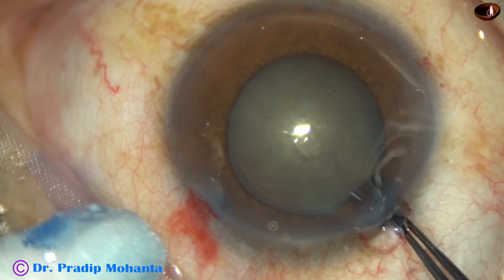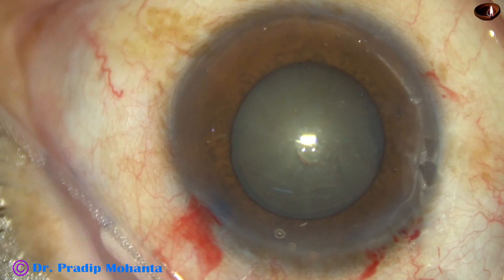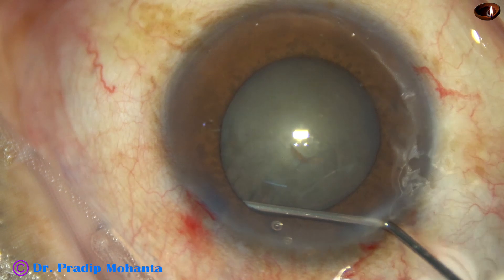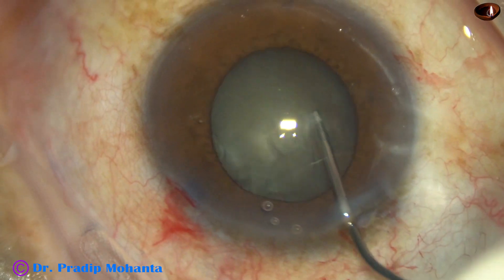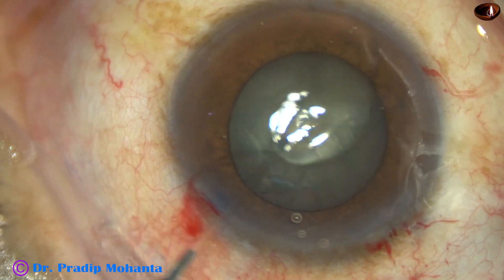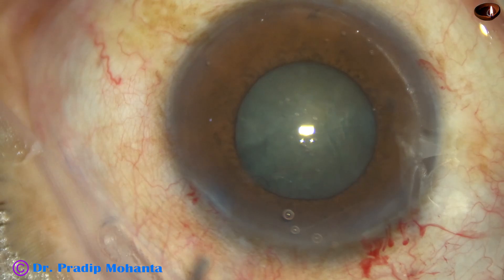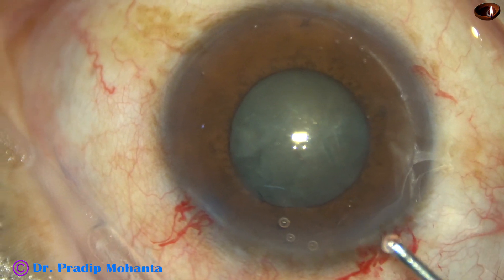This is a mid-dilated pupil and I am expecting floppy iris in this case. Now, as I do hydrodissection and as I rotate the nucleus, you can see the pupil becomes small.